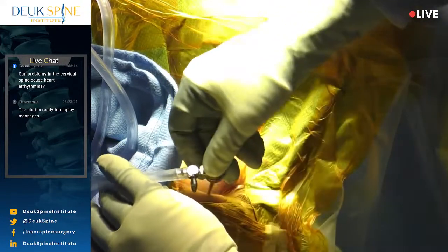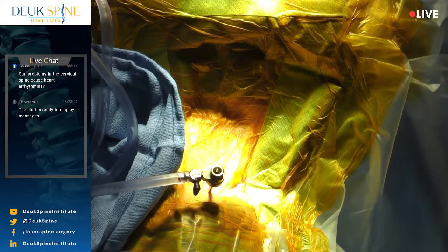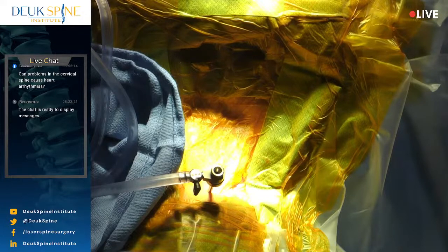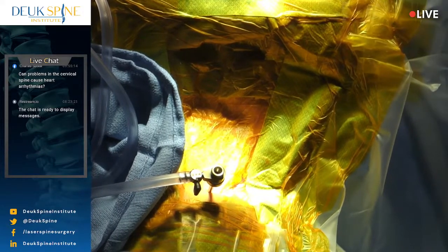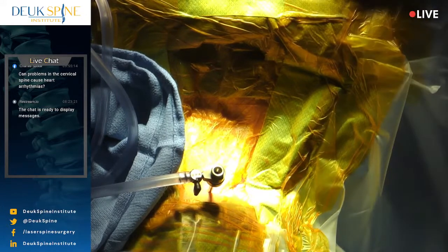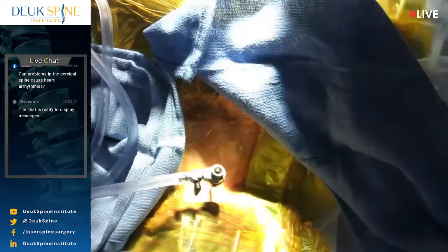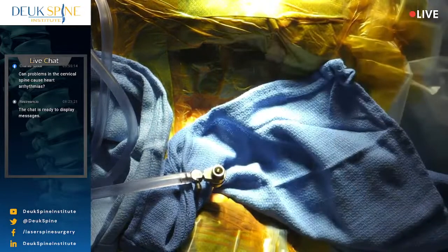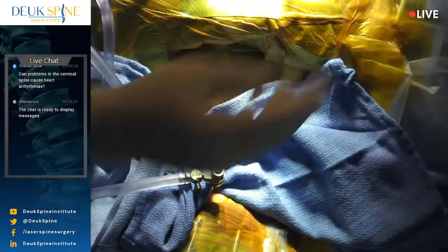Now, I learned this approach and technique from the Koreans. When I learned it from the South Koreans 16 years ago, they were the first to do cervical, and they were having the patient awake. The patient was squirming around the operating table under propofol sedation. The reason they had the patient awake, the way they told me, was because they wanted to know when the nerve was unpinched, okay? So they would wake him up enough, and the patient would say, oh yeah, my arm pain's gone, in Korean, of course.